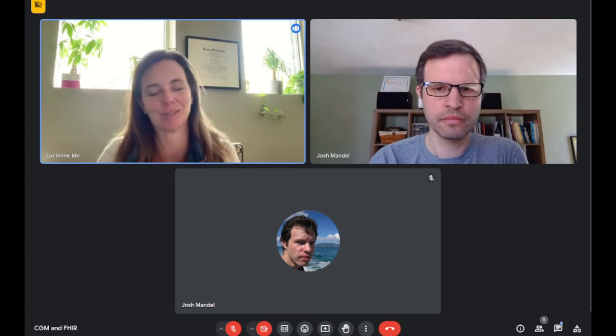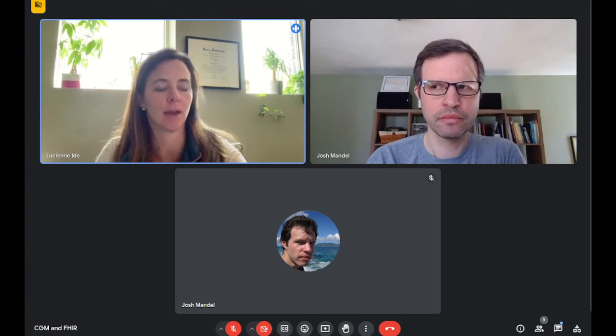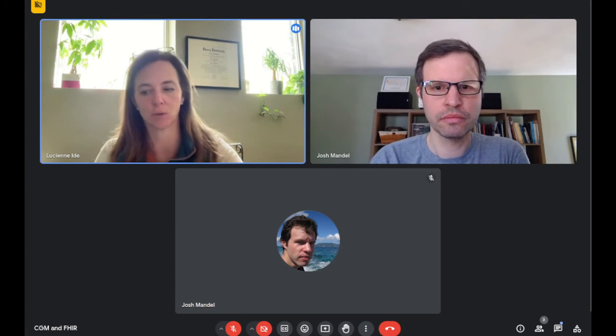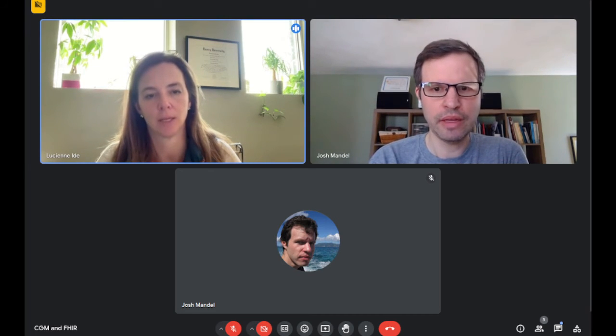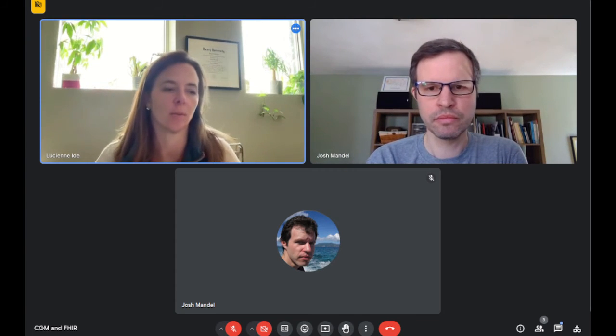Like having it in Rimidi doesn't do you any good. And so that's why we have ended up doing data write back using HL7 web services into flow sheets, so that blood pressure data is there to feed into their quality reporting. The same thing, everybody I talk to believes, is going to happen with CGM: that time in range will become a quality measure. And therefore, we need to get it into the EMR.